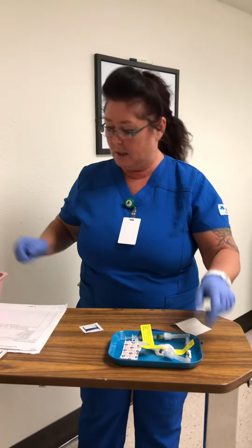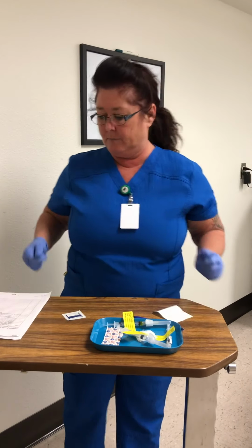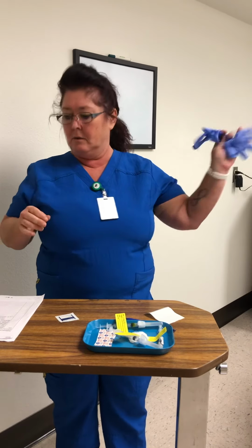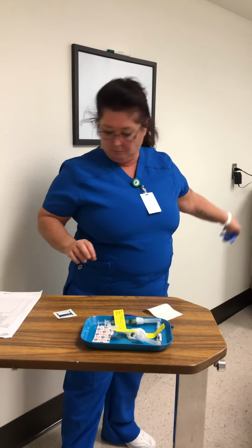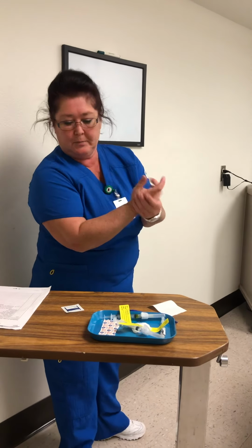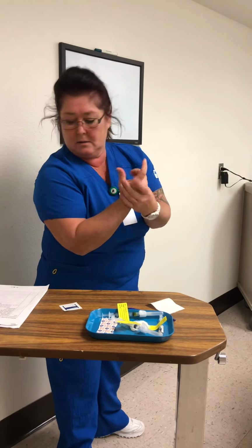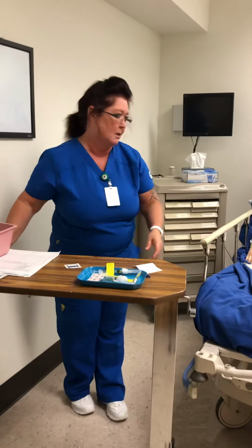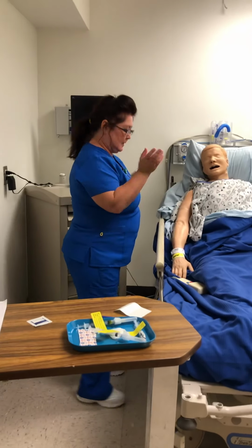So I would go into the patient's room with my meds, discarding my gloves into the garbage. I'm going to go in, perform hand hygiene. I have my MAR and my meds. I'm going to come in, I'm going to introduce myself to the patient.